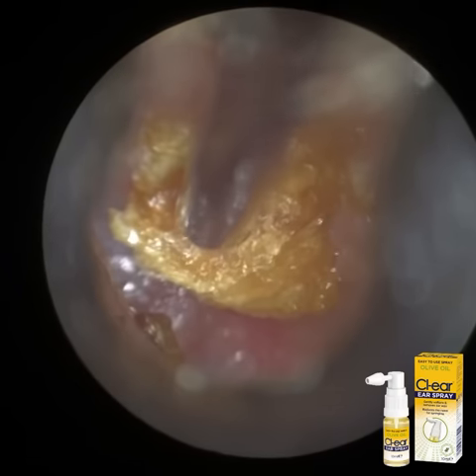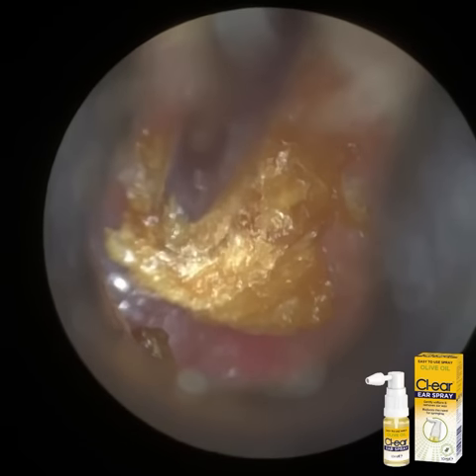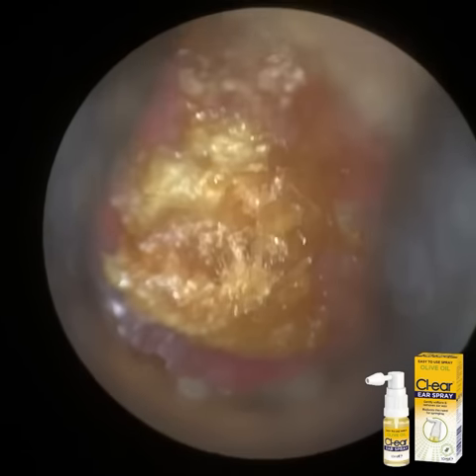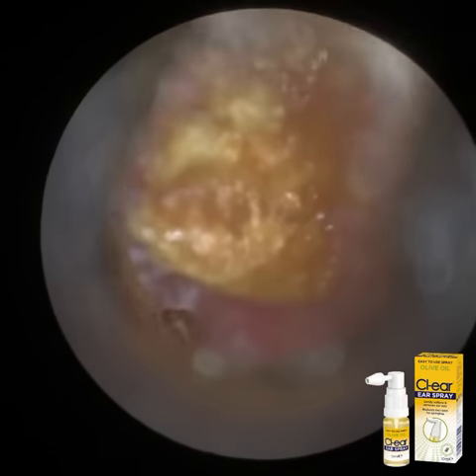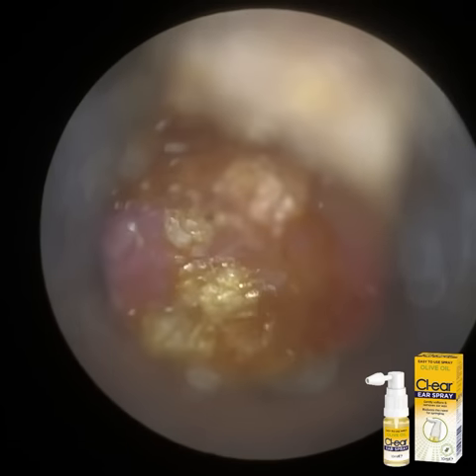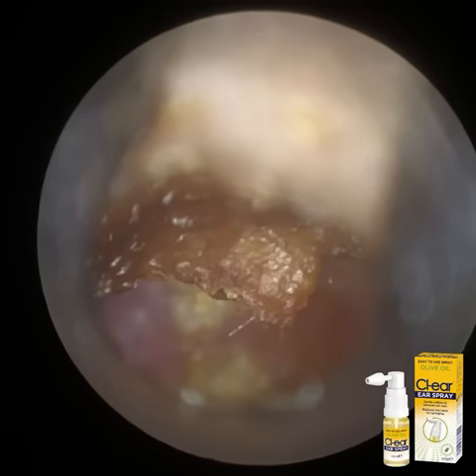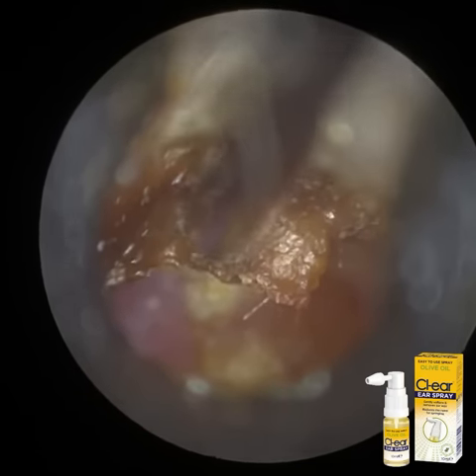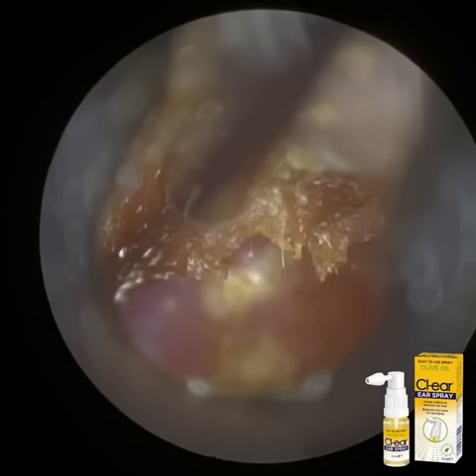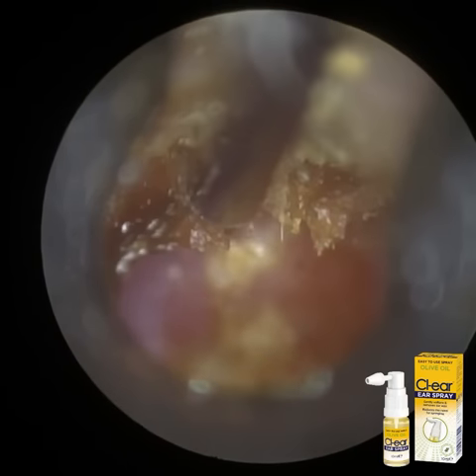You could compare, in essence, the view with the WAXscope to an ENT operating microscope. With an ENT operating microscope, you've got stereoscopic binocular vision. So here you're still able to acquire depth perception, but using monocular cues. The two main cues that are used to get depth perception using monocular vision are focus. When you've got the image in focus, that really does help to provide depth perception. And a phenomenon called motion parallax.